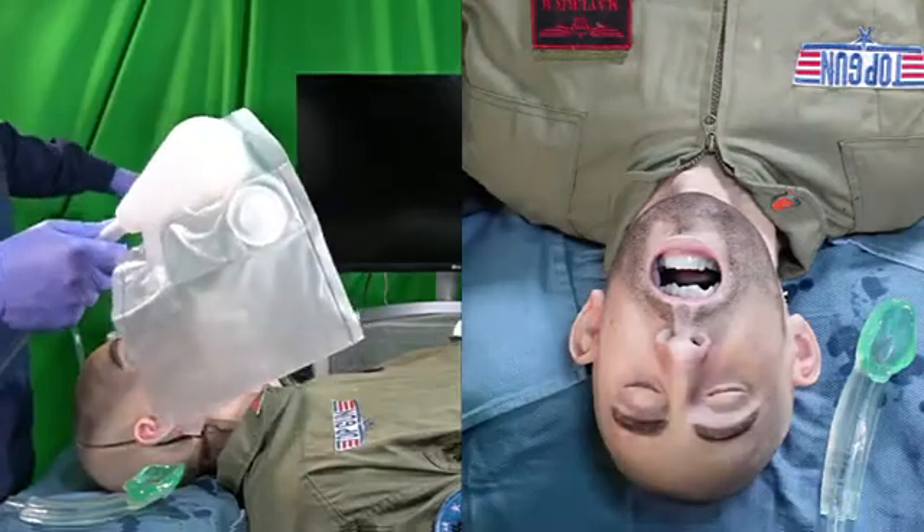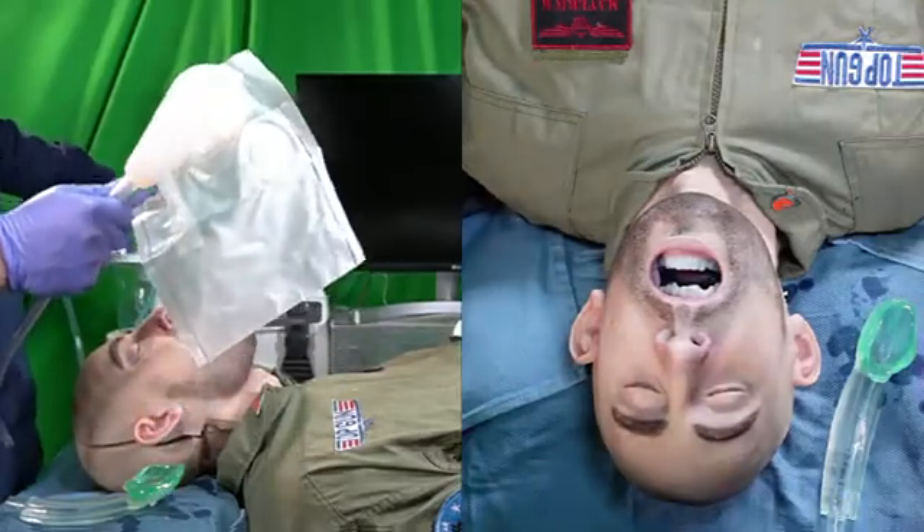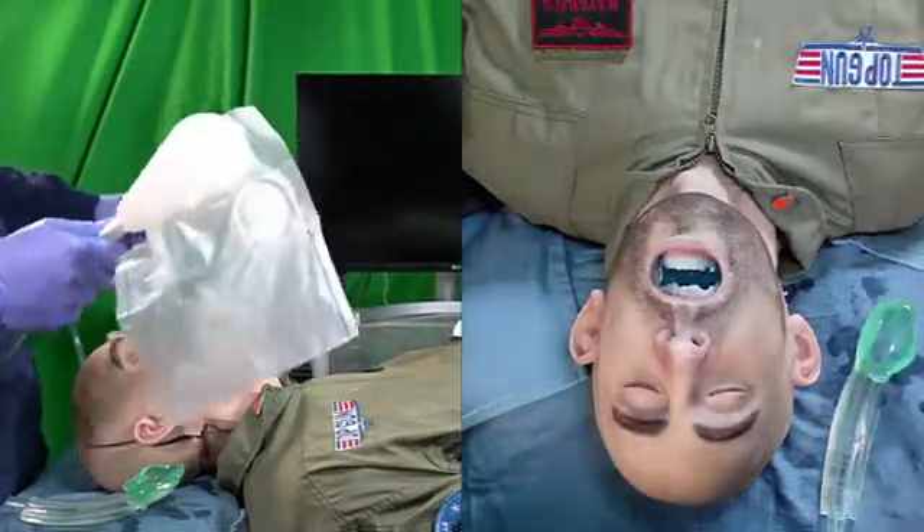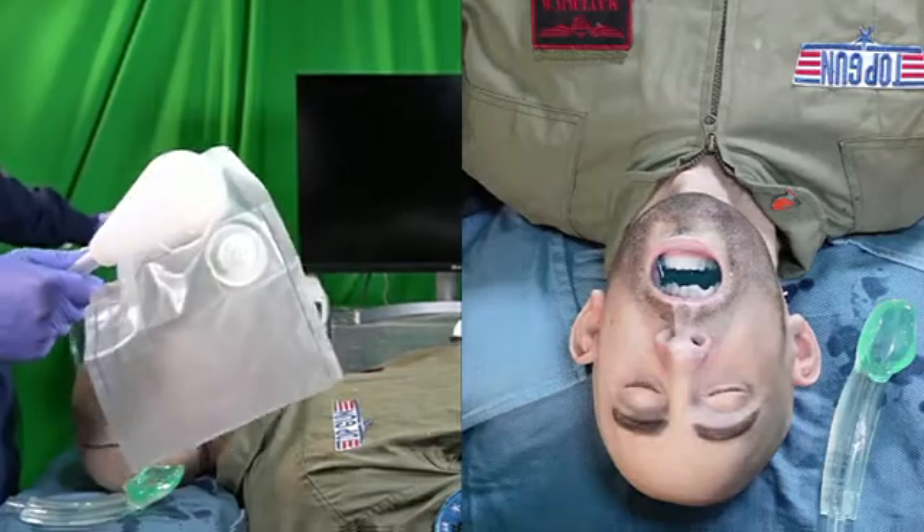So let's recontaminate this airway and do this simulation from the beginning — we're going to really muck it up here. You can see the mannequin's got a full mouth of airway contaminant now.